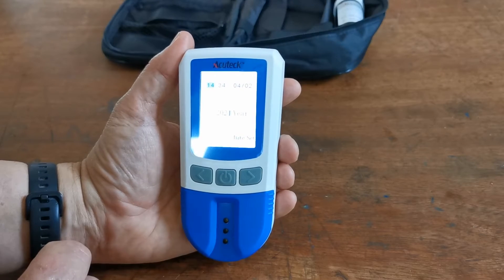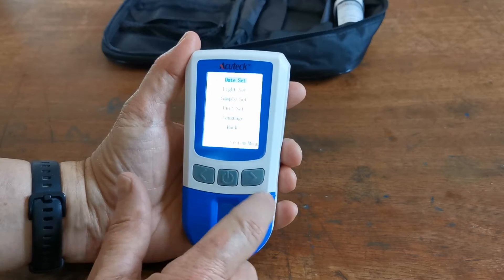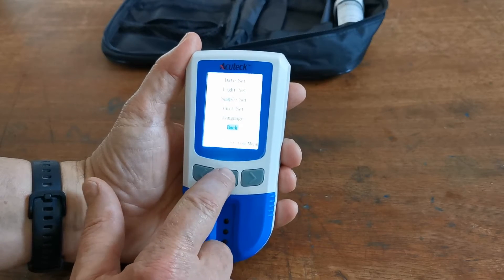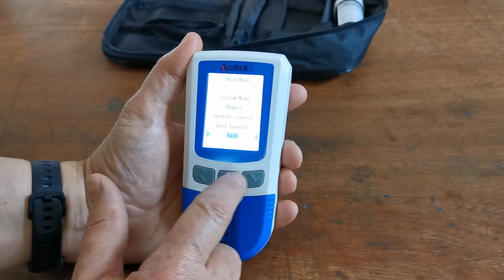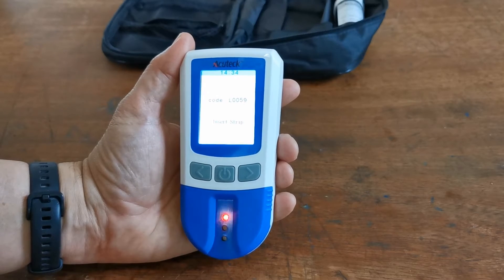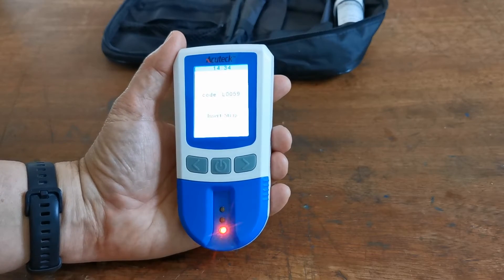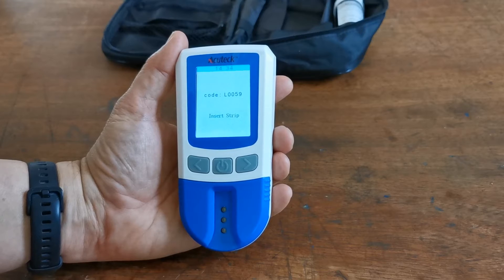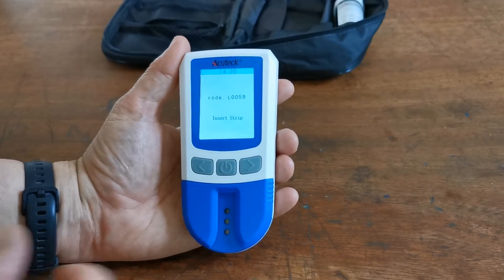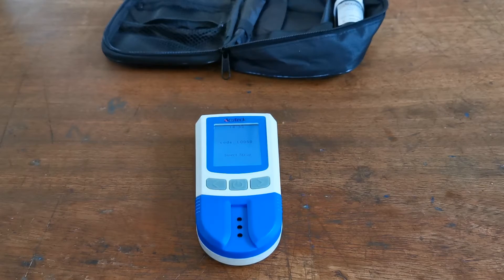You can either leave the meter to power down naturally, or if you want to move through to running a test, hold and depress the power button again. Navigate down to back and then to exit. It should now be fully programmed with the time and date. It will then ask you to insert a test strip, with three LEDs flashing. If you do nothing, the meter will automatically power down after a minute to save battery power. When you are ready to perform your first test, it will retain the date, time, and readings for you.